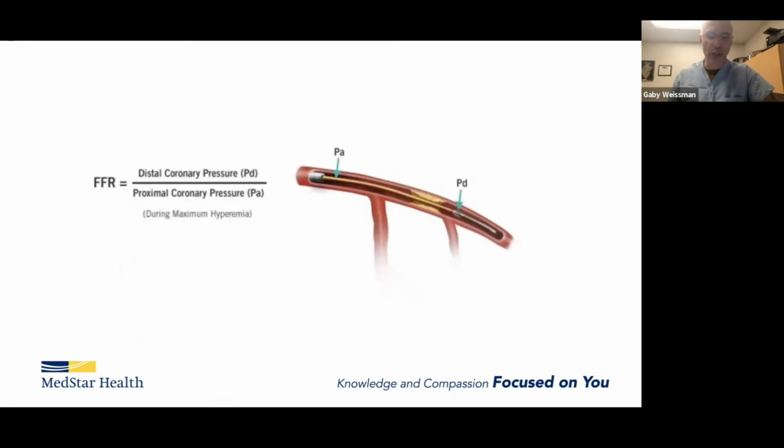So have there been trials looking at ischemia? There have been a few now. The FFR is an invasive equivalent of ischemia testing. So basically in the cath lab, we put a wire beyond the lesion, we measure pressures distal to the lesion, proximal to the lesion, we give a vasodilator, and we watch for a pressure drop. If there is a significant pressure drop, then the lesion is significant. And this is sort of an invasive way to get that physiological information.